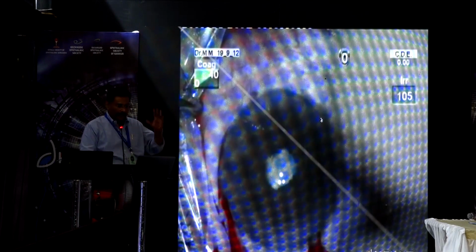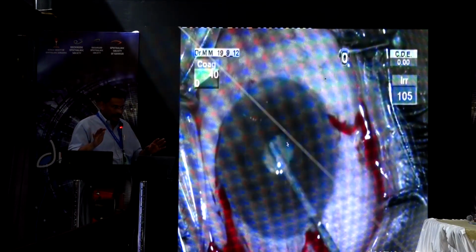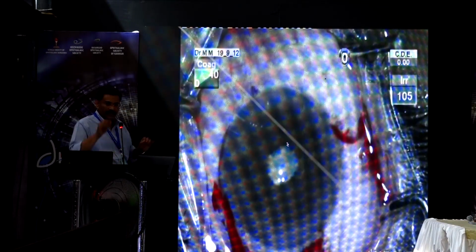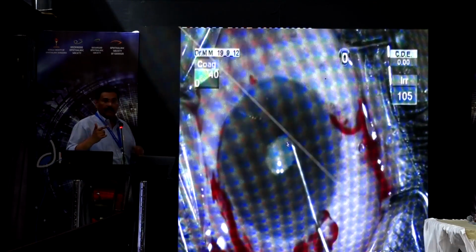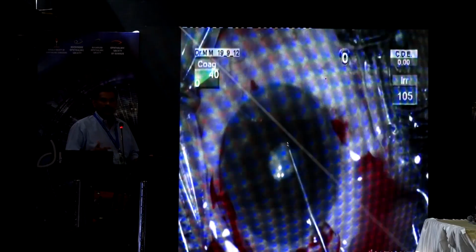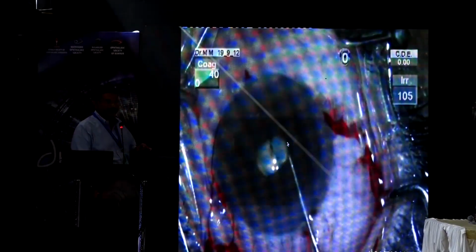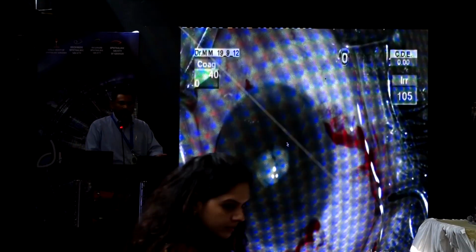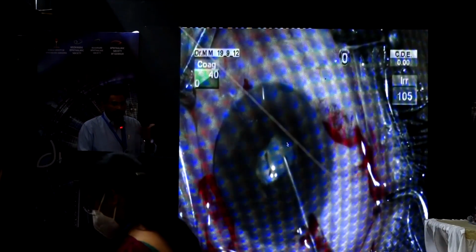A 5.5, 5 millimeter rhexis is more than enough. So don't pull back. See, some cases look like this. It will look all fine, but there are membranes covering this kind of mature cataract. So if you identify the gap area at the pupillary margin and then retract these membranes, only then can you approach the nucleus or the capsule. Otherwise you cannot approach. So try to identify, see I am trying to get a separation, and now you can separate. Then use forceps and separate, and then continue with the surgery, because here you can stain after putting the hooks.